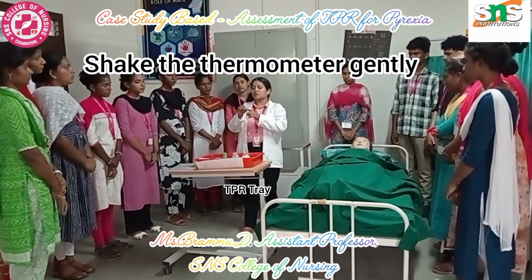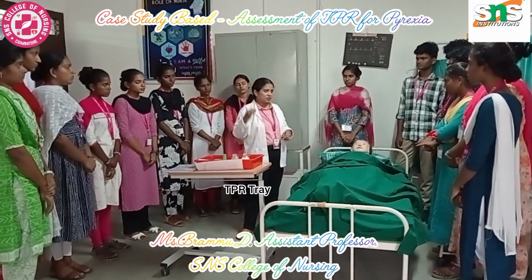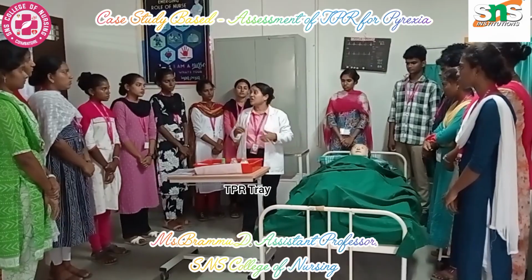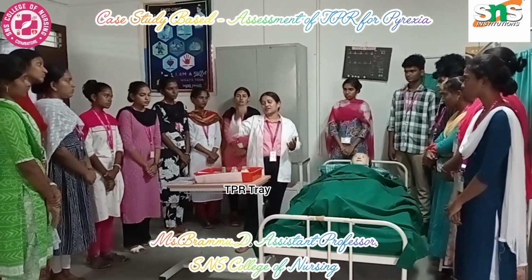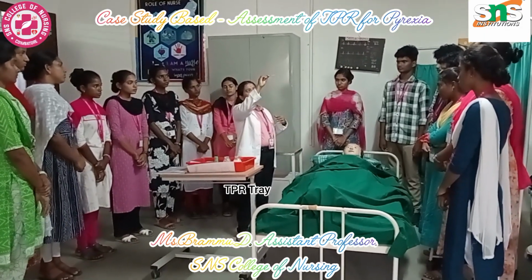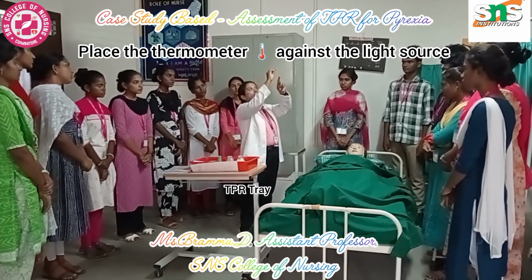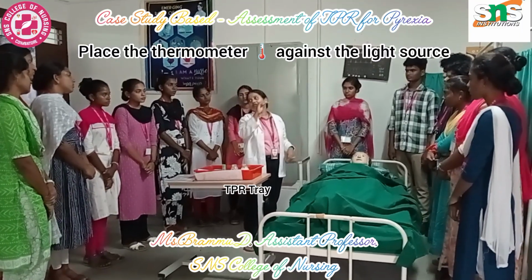If the temperature has already been noted as 101 and you are not shaking the thermometer, if it is a mercury one and you place it onto the patient, the patient may show a higher temperature reading. That's why you shake it for at least 2 to 3 seconds, not dropping the thermometer. Check it against the light source and see that the mercury has come down here. So when you keep it against the light source and just dangle the thermometer, you can see the changes.